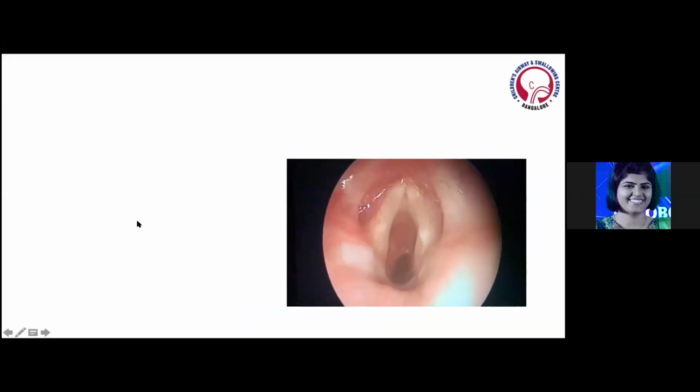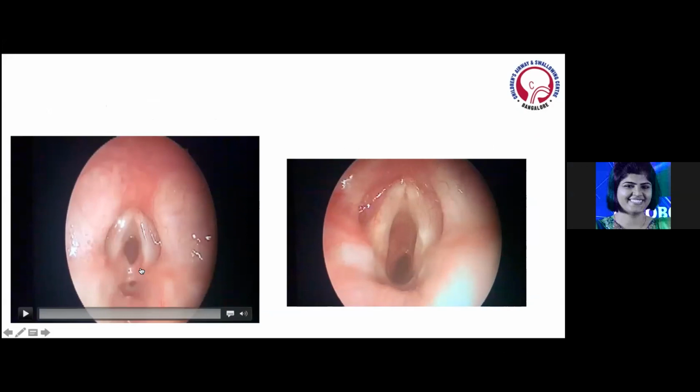Quickly. I just want to understand basically what Kishore sir said. Okay, this image is the first video and this one is the post-op one. So here, this band which we dealt with scissor, and we can make out this posterior thin line is already there. Yeah. This is already there, which still remains. We did not do anything. So if we are using the laser, you want me to cut that part as well, or just leave it like that?